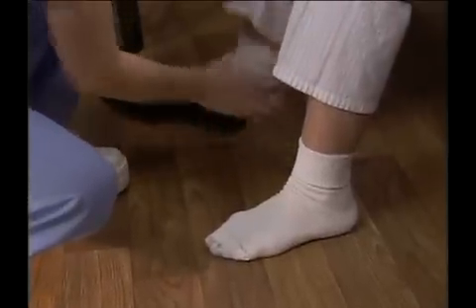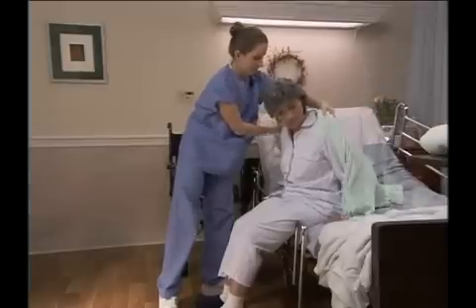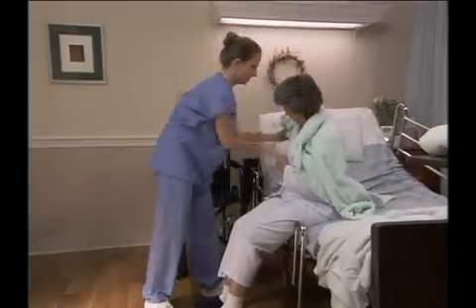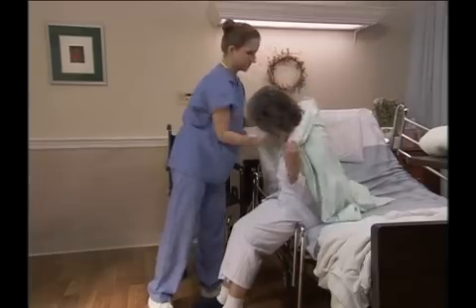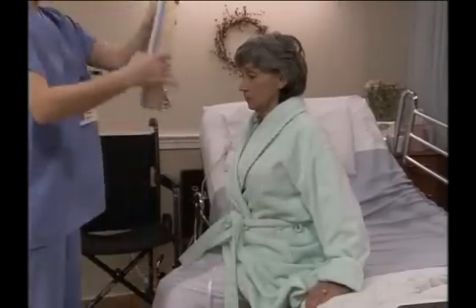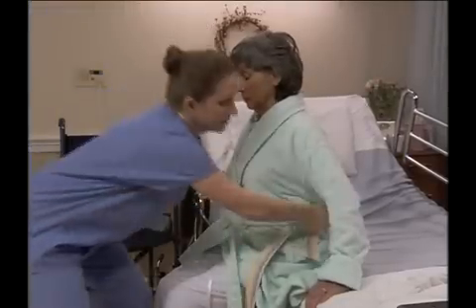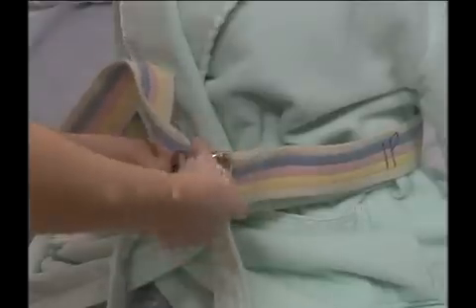Next, help the person put on her shoes or slippers and help her into a robe. For safety, make sure that clothing doesn't interfere with the transfer. When the person is ready, apply the transfer belt around her waist, over top of all clothing. Buckle the belt in front.